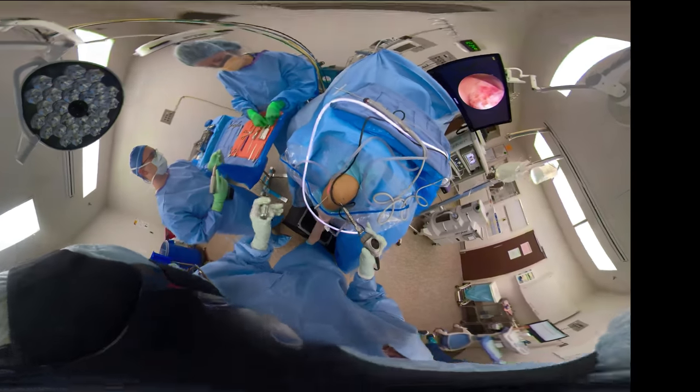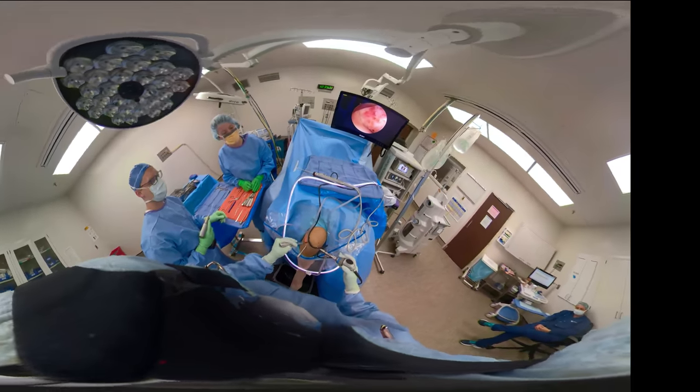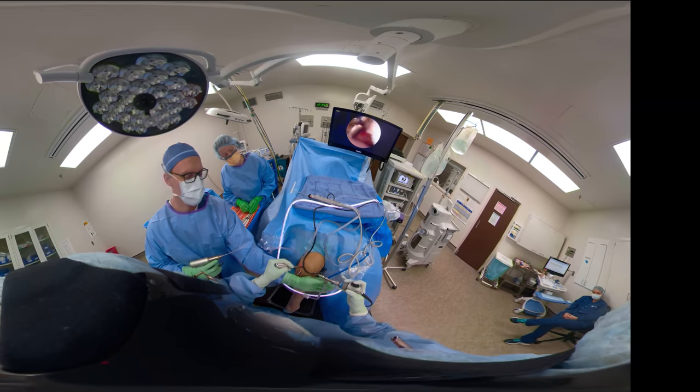So looking at different curettes that we can use, you can use an open curette, you can use a closed curette.